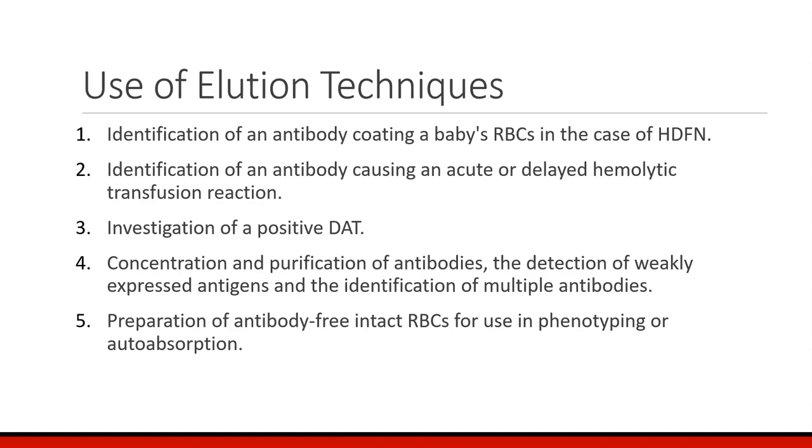There are times, especially in cold autos and even warm autos, that we'll need to adsorb out the autoantibody so that we can see if anything is left in the serum. But we can also use that elution technique to remove antibodies to free up antigen sites on cells so there's room for more autoantibody to go on. So again, I went through this relatively quickly. Go ahead and spend some time on it, but just know we will come and revisit this again.